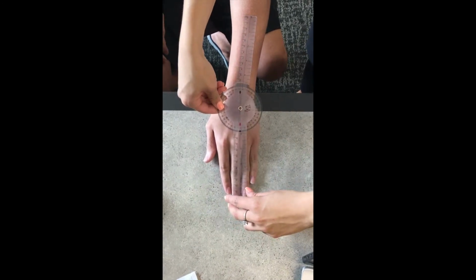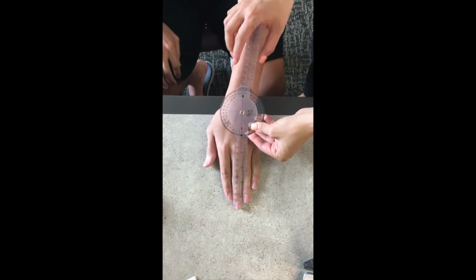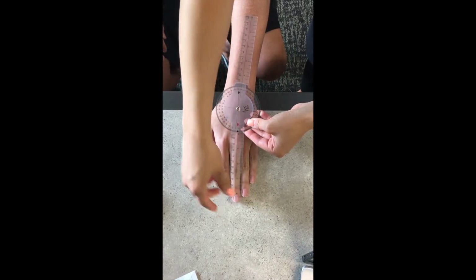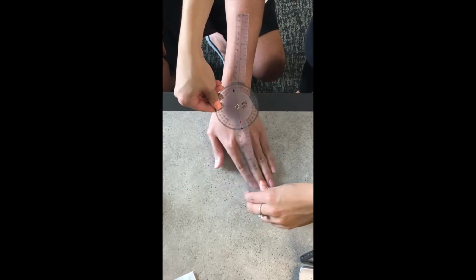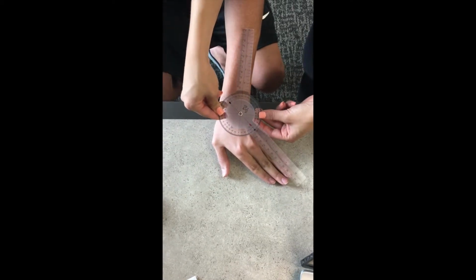The muscles causing ulnar deviation are the extensor carpi ulnaris and flexor carpi ulnaris. This motion occurs in the frontal plane, and the axis is the anterior-posterior axis. Normal range of motion for ulnar deviation is 30 degrees. The subject had an ulnar deviation range of motion of 29 degrees.